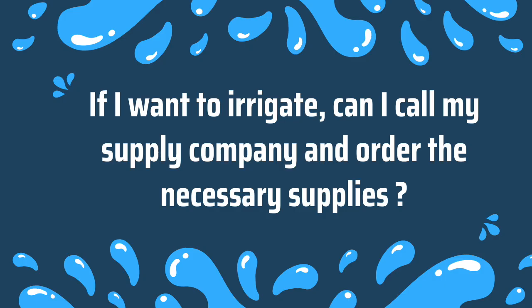What if I decide that I'd like to irrigate? Can I just call my supply company and order irrigation supplies? Well, that depends. If you want reimbursement from your insurance carrier, you're going to need to obtain a prescription for the supplies from your doctor. If your doctor agrees that you're a candidate for irrigation, he or she can fax or email the prescription to your ostomy distributor, your DME. However, if you're going to purchase the supplies independently, you may not need the prescription.